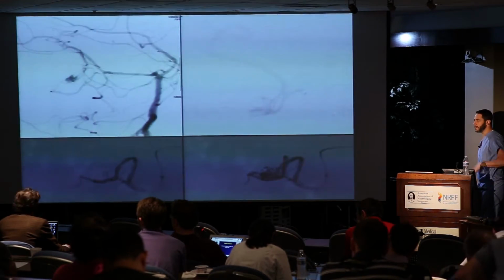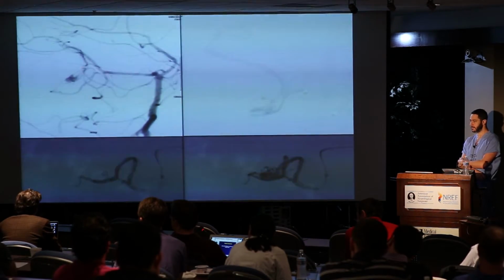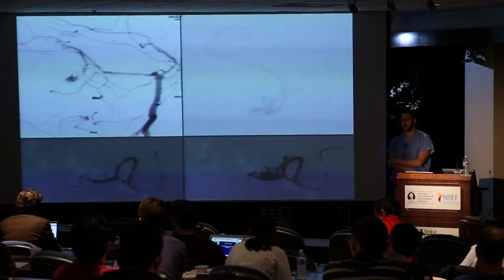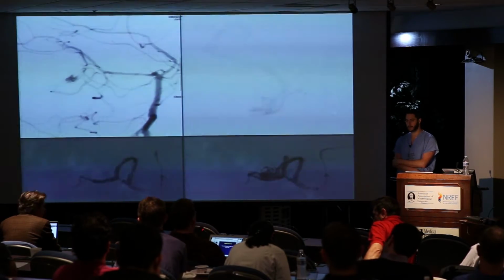Particularly external, what's awesome is Scepter. If you haven't done Scepter plus Onyx, it shocks me how flexible and far you can get with that balloon. I've actually moved to doing secondary intracranial. If I have any reasonable access intracranially, I use a secondary intracranial.